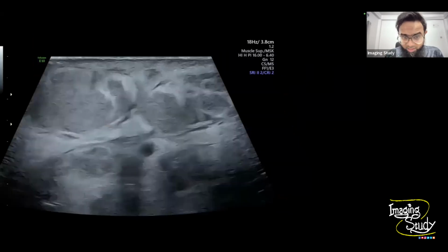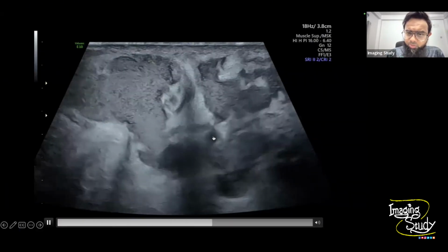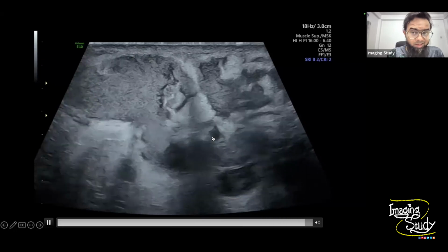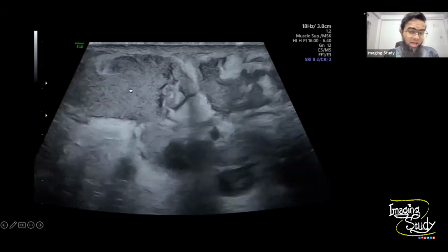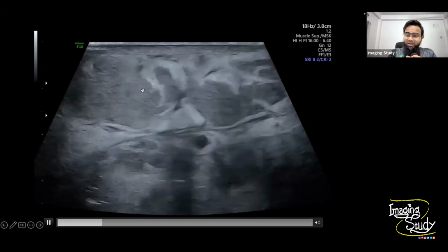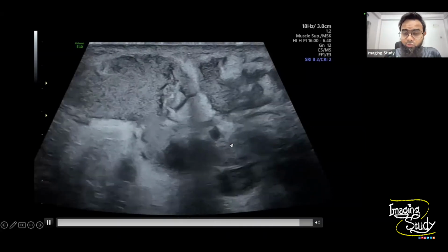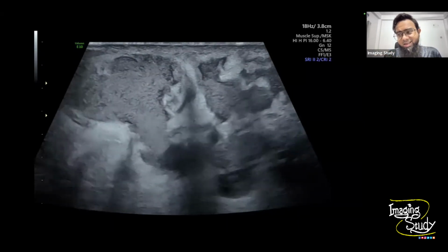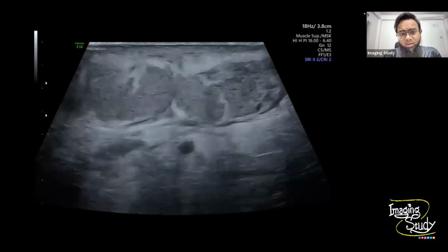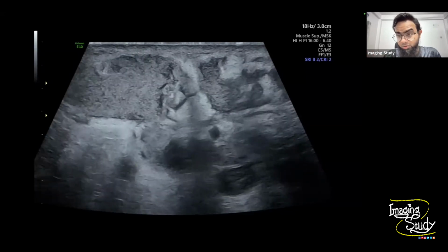Okay. Oh, one thing. You see this structure over there? This one should be a blood vessel. Now, this is a little bit of an alarming sign. Like, oh, I have found an abscess, now I will stab it. So you can injure this vessel. So in your report, you should comment on the encasement of this vessel by this abscess. Otherwise, the clinician may puncture this one also.